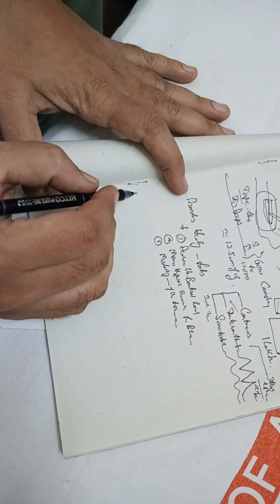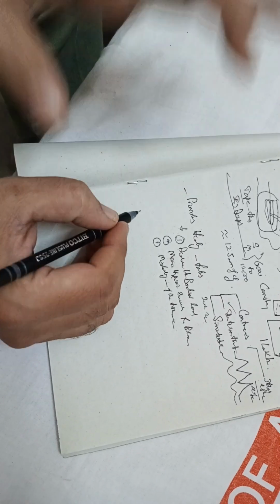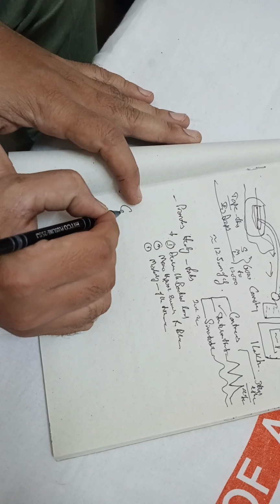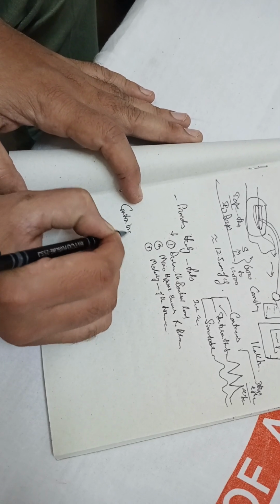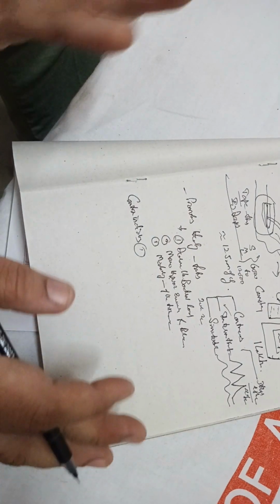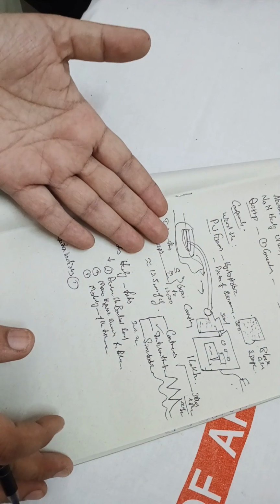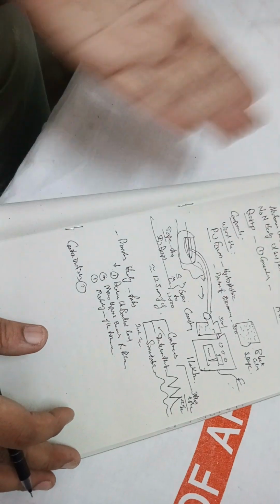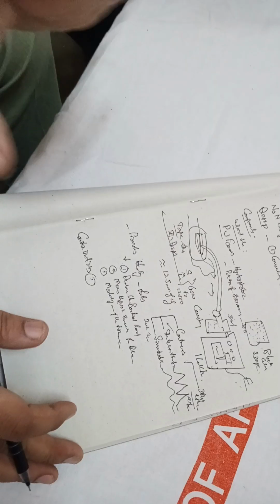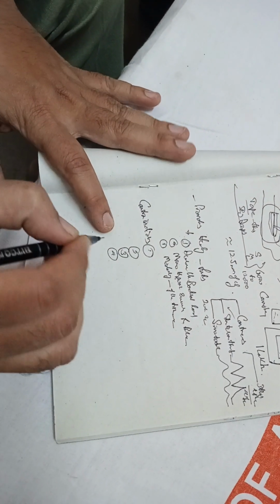So after discussing this, you need to know when to use it, when not to use it. There are certain contraindications for that. Indications we will not discuss because a non-healing ulcer is the indication. Like that you can enumerate a number, but you should know the contraindications. That is very important. So there are four main contraindications.